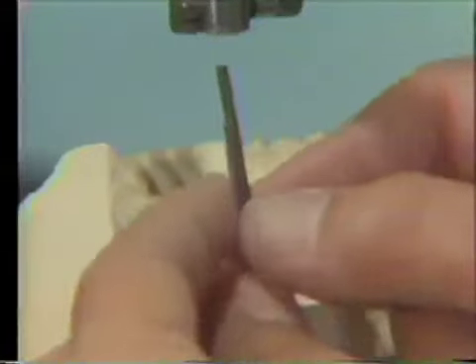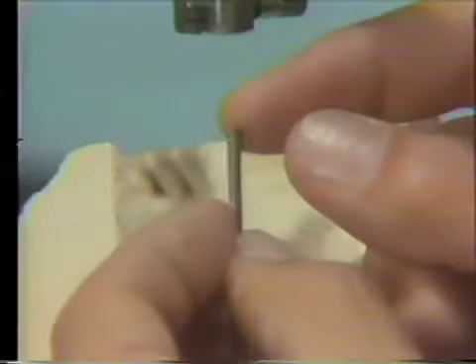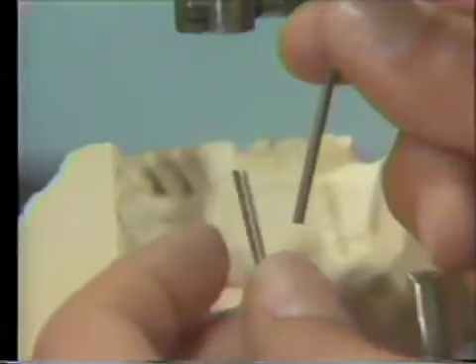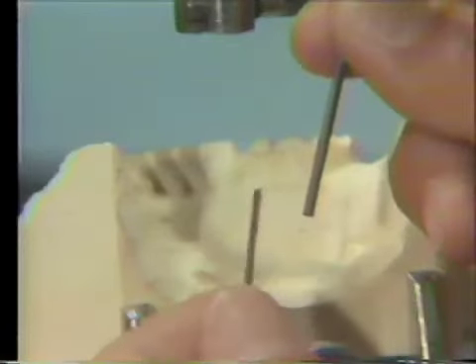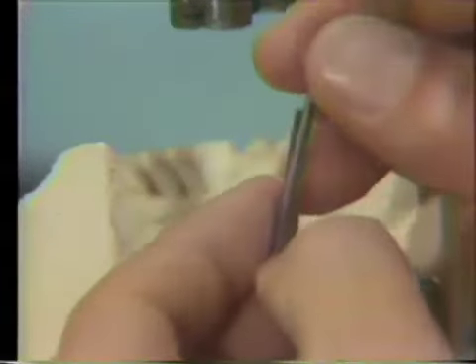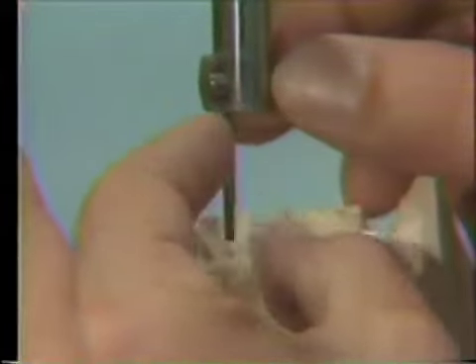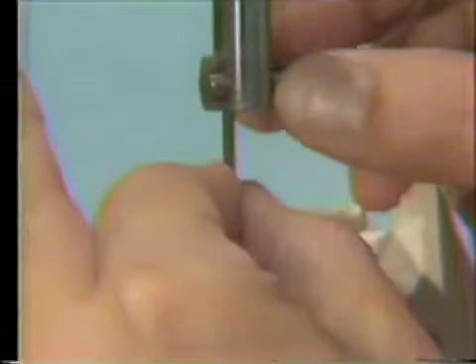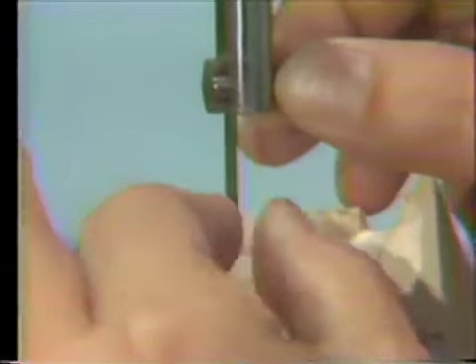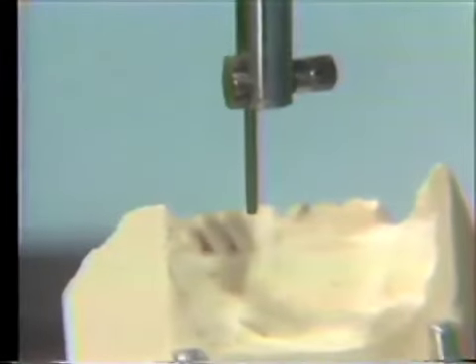So we're going to use a metal shield, which is of a half moon shape, and it merely wraps around the carbon, and that part of the carbon we will place toward the set screw. Now I'll then secure that firmly, but not really bearing down on it so that the carbon does not fracture.